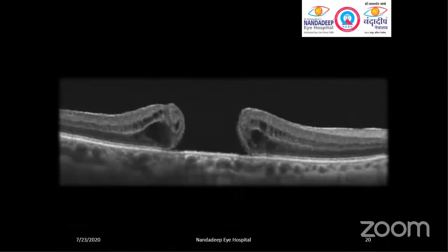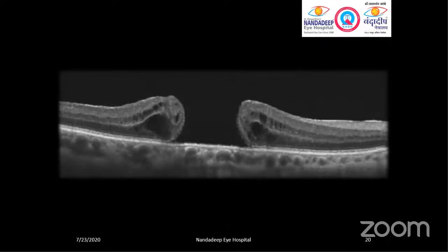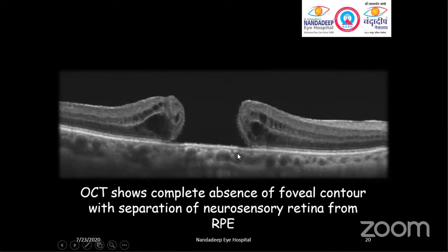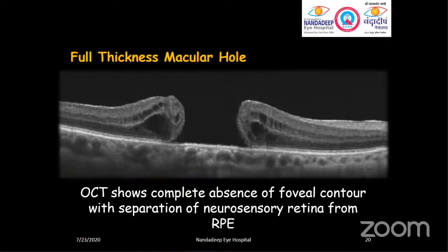This is a very common picture encountered in diagnostic clinics. Here there is complete absence of foveal contour — this area is totally separated. At the same time, there are cystic spaces and complete separation of the neurosensory retina. The retina consists of two broad layers: the retinal pigment epithelium (the last extension of the choroid) and the neurosensory retina, which consists of nine layers. The entire neurosensory retina has been completely separated — only the RPE is intact. The OCT reveals complete absence of foveal contour with separation of neurosensory retina from the RPE. You see this kind of case in patients with full thickness macular hole.